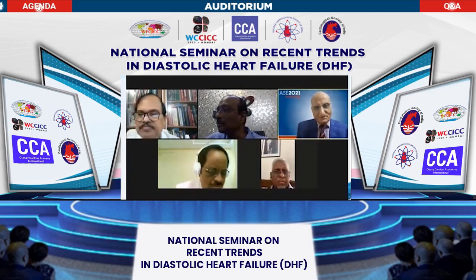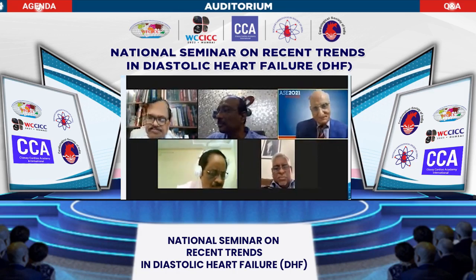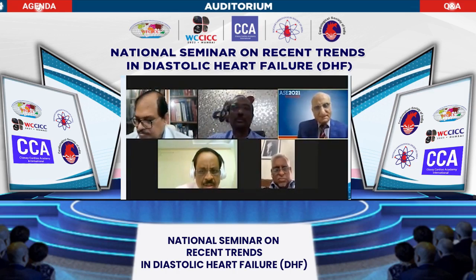In early stages, there is no definition of early stages. It is relaxation abnormality or myocardial stiffness. By the time myocardial stiffness starts, your diagnosis will be much easier by Doppler, unless it is a simple relaxation abnormality, which may be found in any number of cases also. So yes, definitely it is helpful once there is a grade slightly more than grade 1 or so.